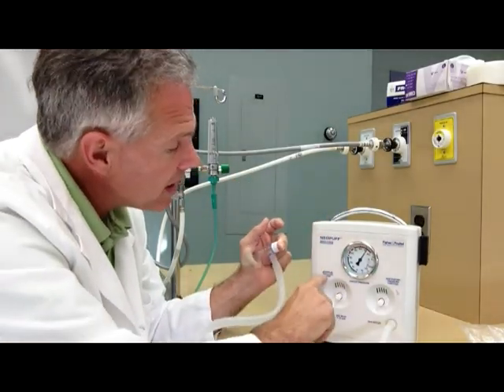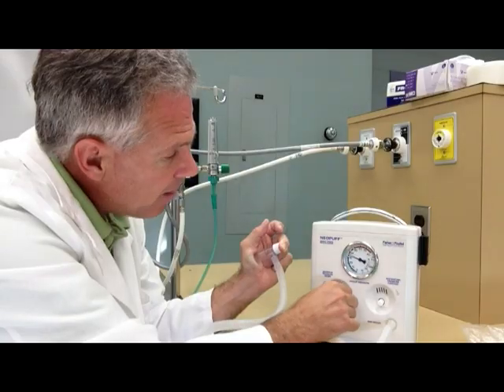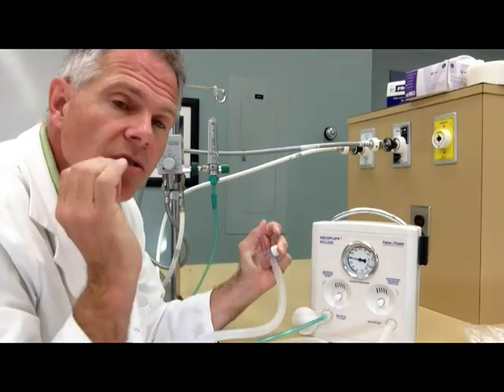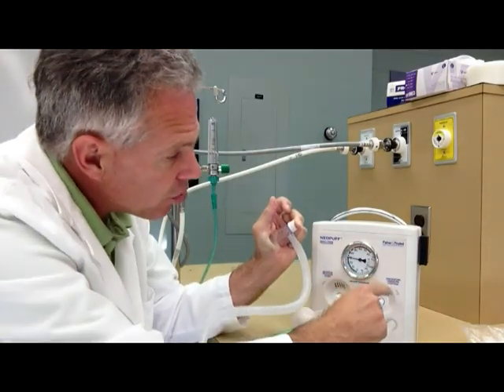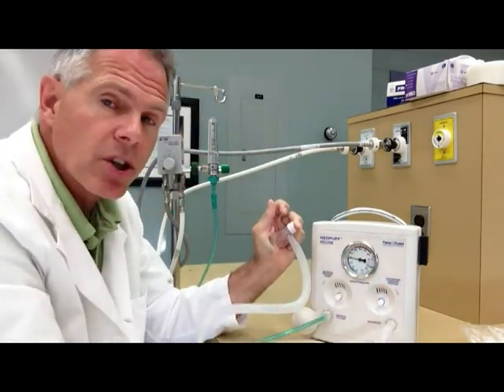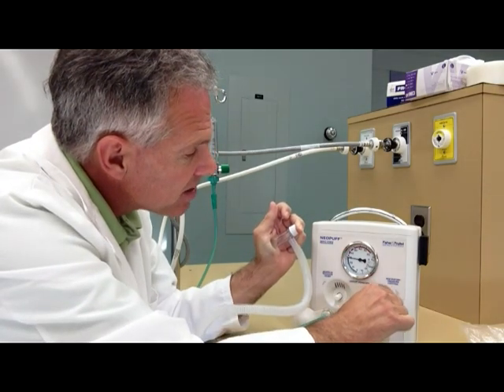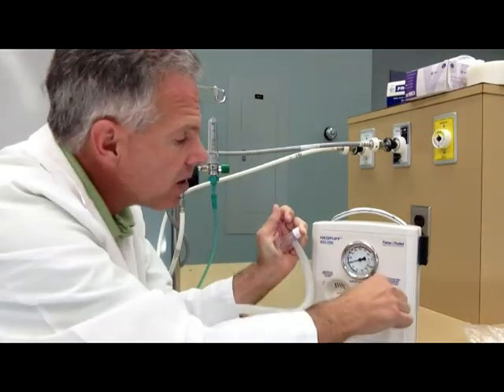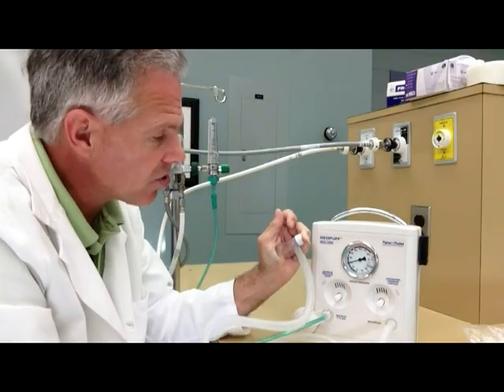The next thing I want to do is set my maximal pressure relief. I turn that counterclockwise and I'm going to set that at about 30 centimeters of water pressure. We shouldn't have to use any more pressure than that to ventilate our neonatal patient. The next thing I'm going to control is my inspiratory pressure control, and for our purposes today I'm going to start off and set that at 20 — that's the maximum pressure that should be delivered to my patient during resuscitation.